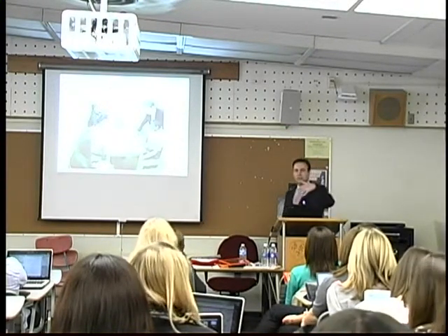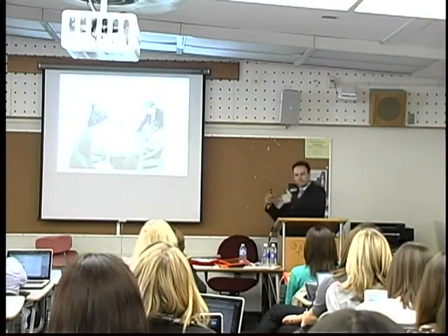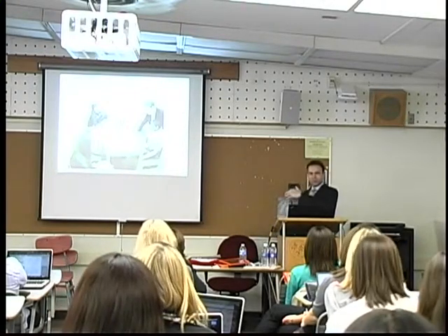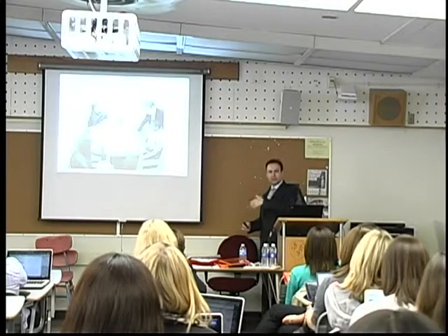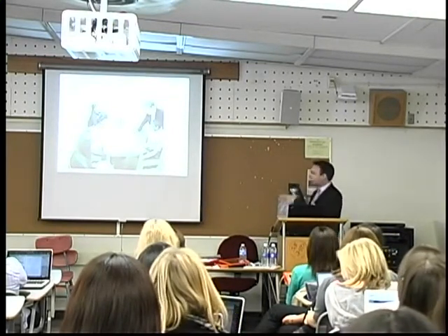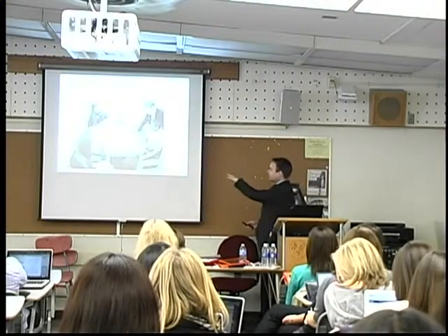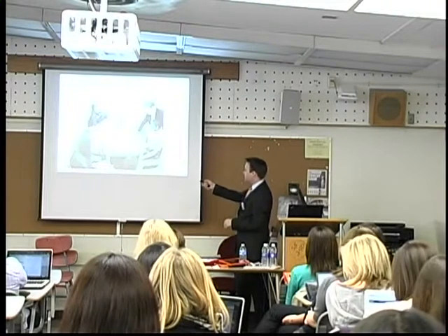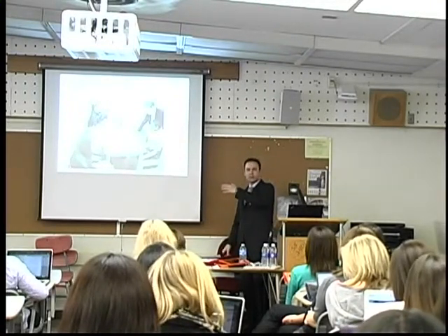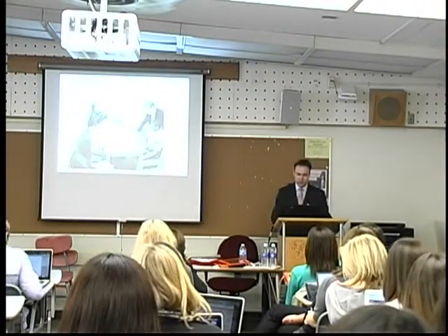So you asked me earlier, what are my thoughts about scripted speech? This is clearly somewhat scripted and procedural, but given where he came from, that he had next to no functional, meaningful words when we started intervention, I consider that good, strong progress. At least we're getting him to this level where he can meaningfully use the device, and we have also seen some good progress in saying the actual words that correspond with the graphic symbols.